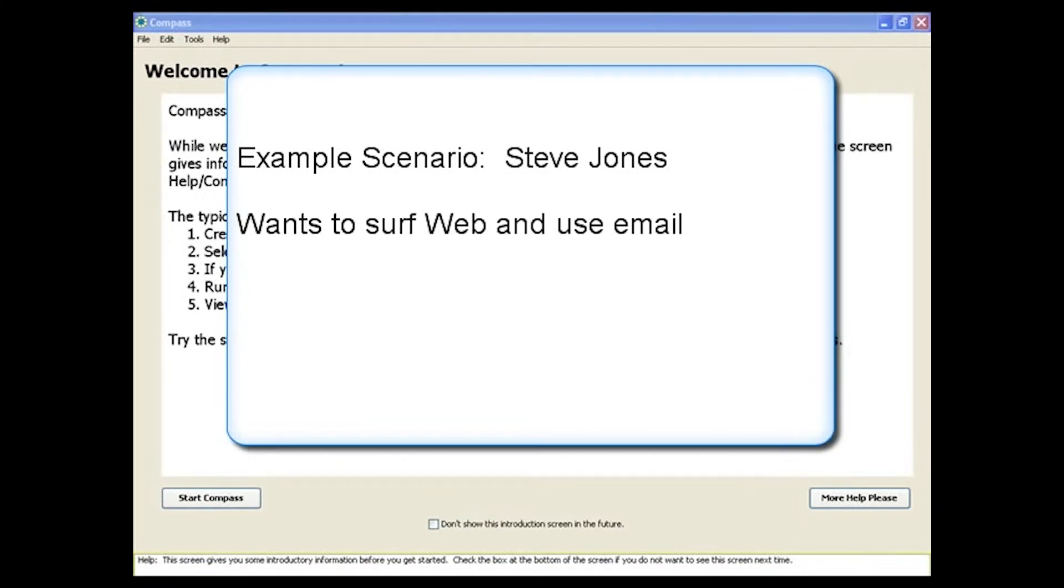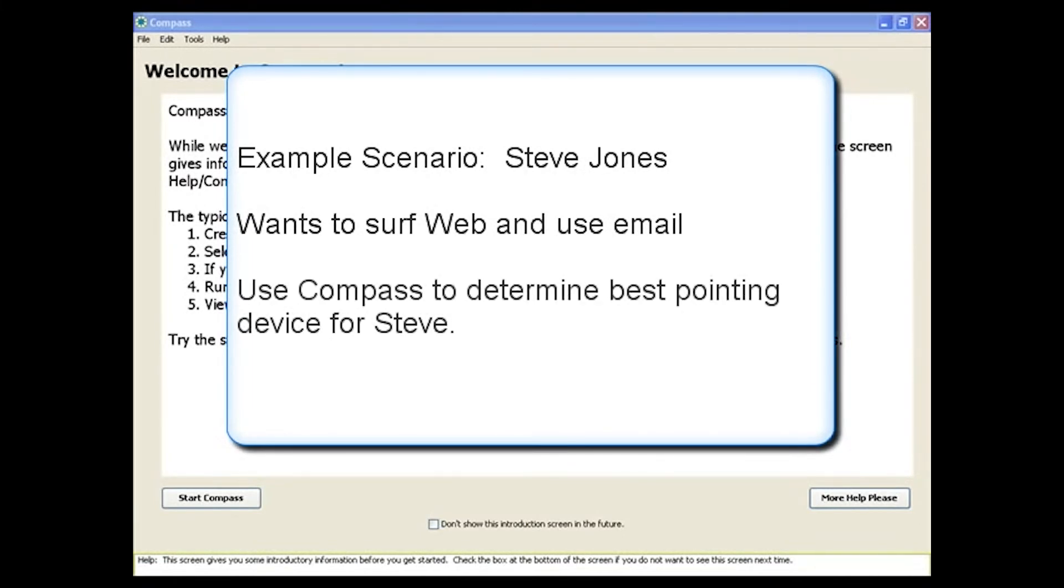He would like to start surfing the web and using email. Let's look at how you could use Compass to help determine the best pointing device for Steve.